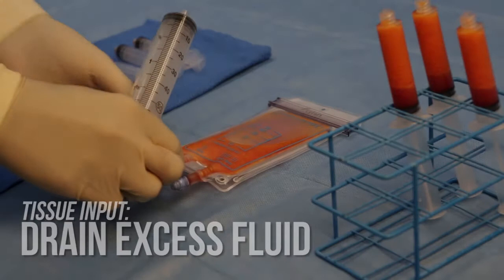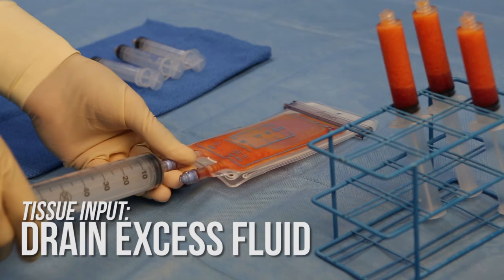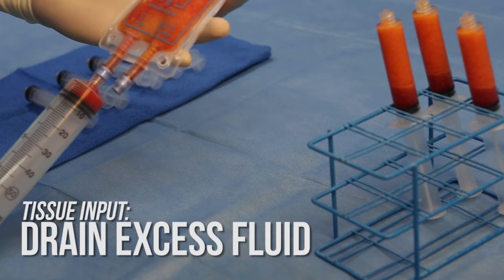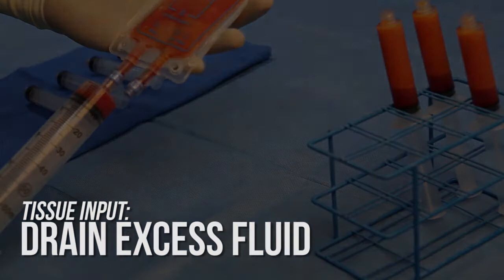Conduct an initial drain to remove excess fluids from the lipoaspirate. Start by connecting a Luer-lock syringe to the drain port. Then hold the PureGraft in an upright angled position and retract the plunger to pull waste fluid through the drain port at approximately two milliliters per second. This technique minimizes clogging and prevents air from being withdrawn in order to avoid collapsing the system.